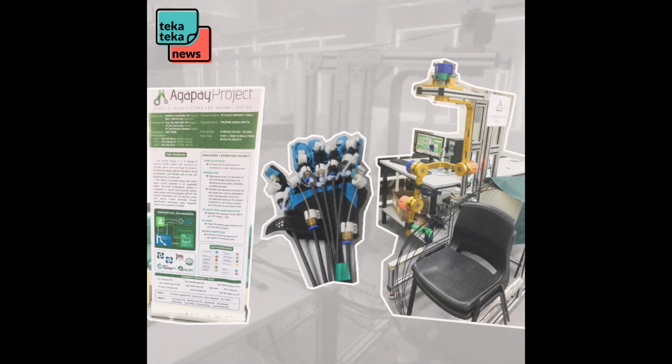Yeah. Kasi sabi niya, the machine will still wait. And then with force of movement, still wait, force of movement. Pero you can program the movement to be so minute na hindi masakit sa pasyente. And the machine will not get tired. We just do the job, sabi niya.